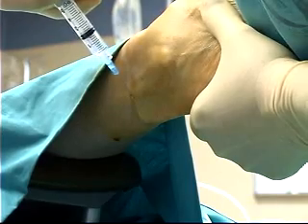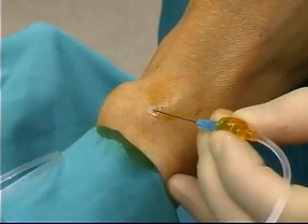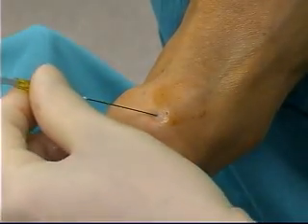The foot is internally rotated, and the valley from the lateral malleolus to the Achilles tendon on the lateral side of the ankle is turned into a hill. Be sure to remain superficial to the fascia with the needle, and be sure that a skin wheal is observed when the sural nerve is blocked. This is a pure sensory nerve, and it does not matter if the skin infiltration contaminates the nerve, as is seen in this recording. The main dose of the local anesthetic agent is now injected subcutaneously and superficial to the fascia, again observing the skin wheal.